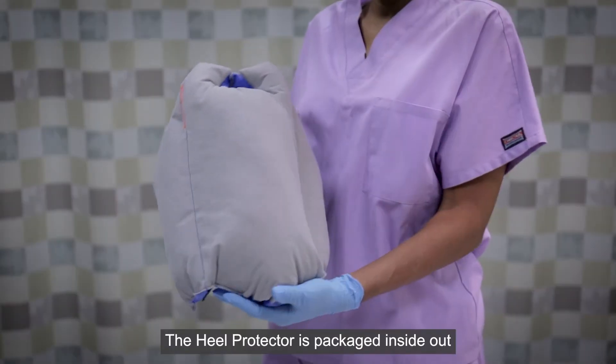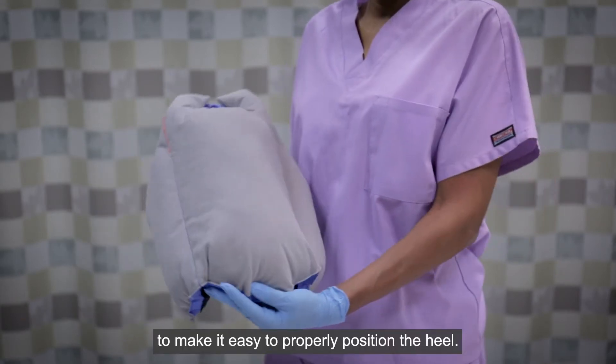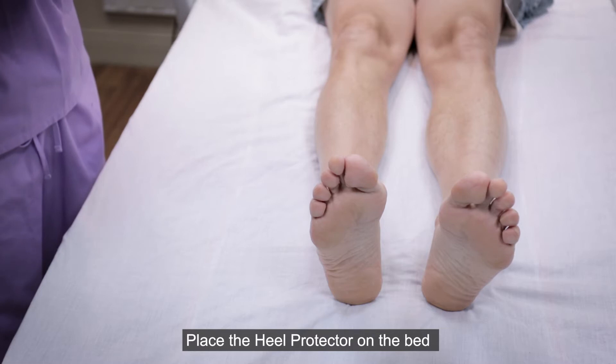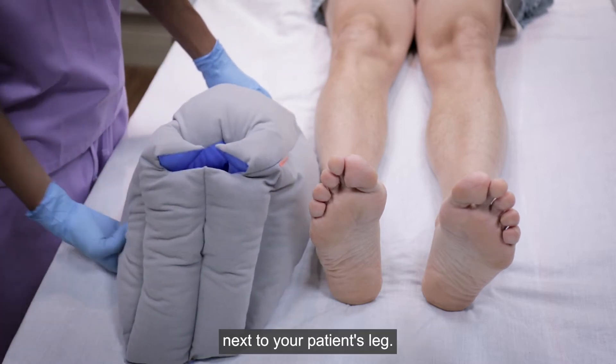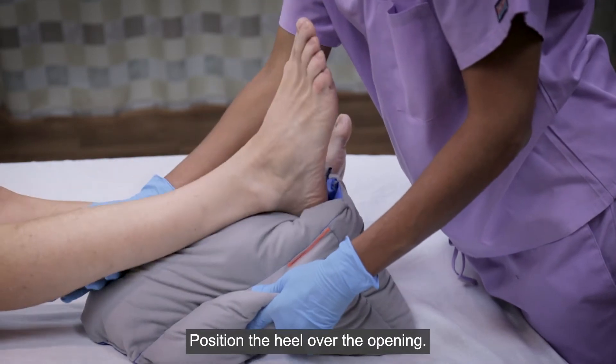The Heel Protector is packaged inside out to make it easy to properly position the heel. Place the Heel Protector on the bed next to your patient's leg. Position the heel over the opening.